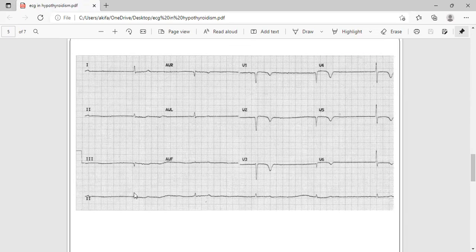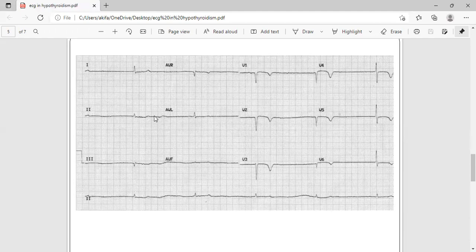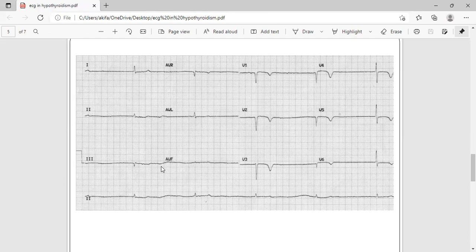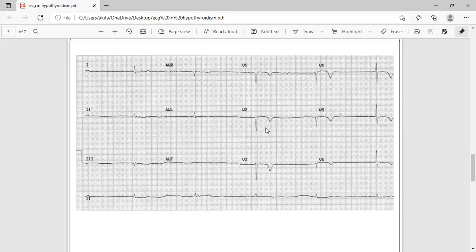Here is a classical ECG of hypothyroidism. You can see the QRS complexes with a large gap between beats, indicating severe bradycardia. This ECG also fits the criteria for low voltage ECG — where the QRS amplitude is less than five millimeters in the limb leads (leads I, II, III, aVR, aVL, and aVF), meaning less than one large square. Leads II, III, and aVF here clearly fit the low voltage ECG criteria. There is also ST-T inversion which may be confused with deep pathological Q waves, but bradycardia and these combined features should raise suspicion for hypothyroidism.